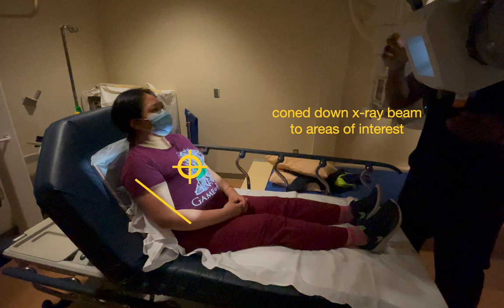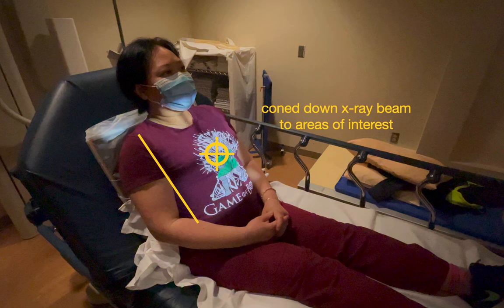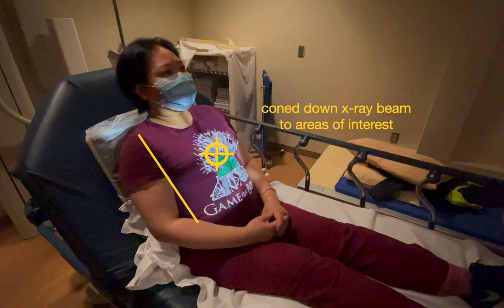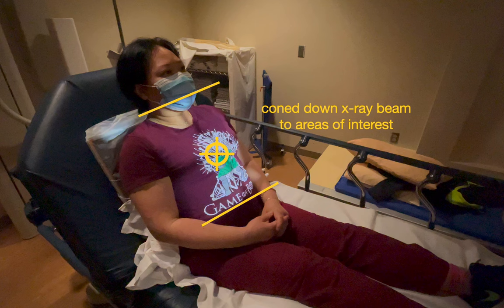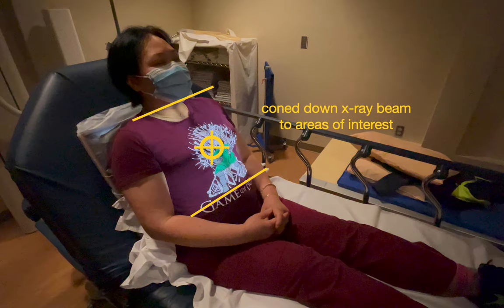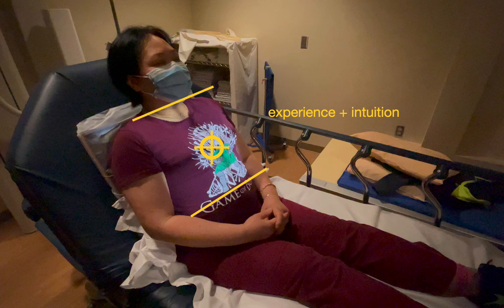Next, the x-ray tech will need to decide if the x-ray beam is wide enough to go through both of the patient's lungs or if it's too wide and needs to be collimated or coned down. In this case you can see some of the visible light beam falls on the patient's arms. Since we don't need to be exposing the patient's arms to x-rays during a portable chest x-ray, the x-ray tech cones the beam down horizontally. The x-ray tech will cone the beam down vertically as well. All of this takes a bit of experience and intuition, as it's a bit of a conjecture as to where a patient's lungs begin and end just by looking at their body.